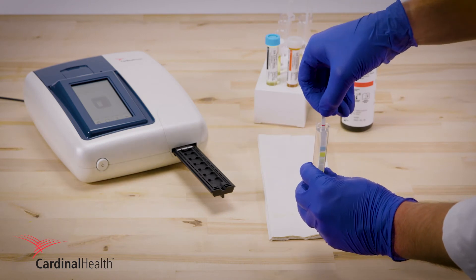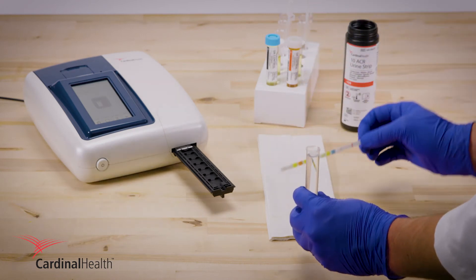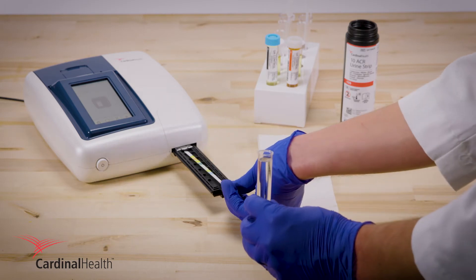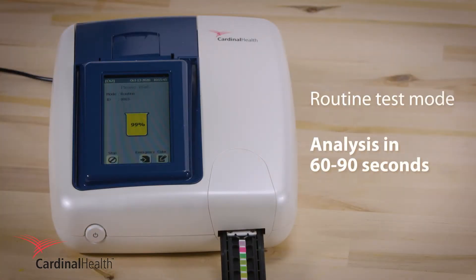Next, dip the urine strip in distilled water. Tap it on a paper towel and place it on the strip holder. Results will display in 60 to 90 seconds.